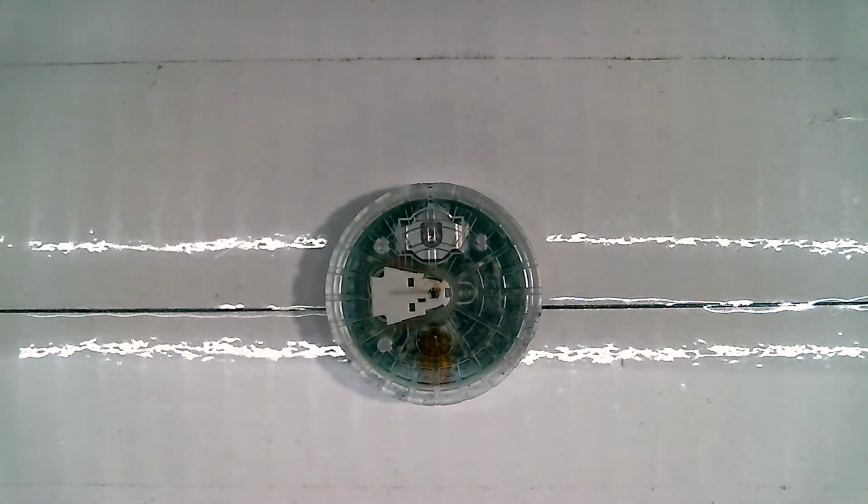All right, everyone. I said once I got this sensor off of me, I would try and take it apart. And I did pull one off of me because they're kind of expensive. I know this is a little close up, but let's talk about this a little bit. So this is what's called a CGM, a continuous glucose monitoring system. And I'll try to demonstrate kind of how this works.